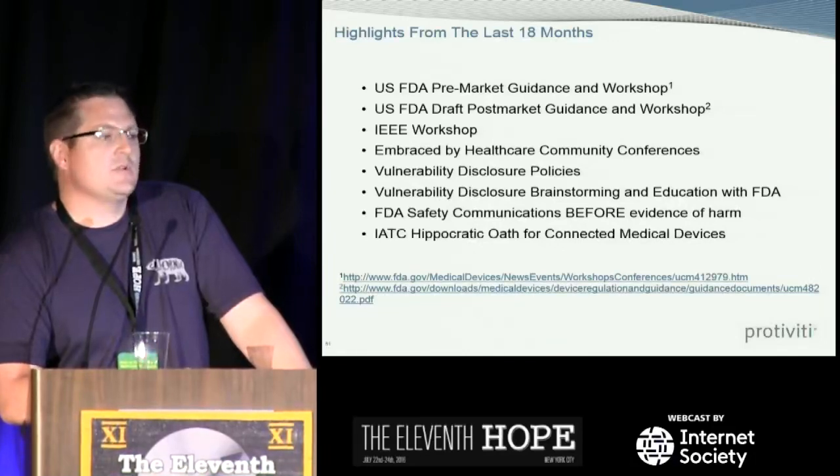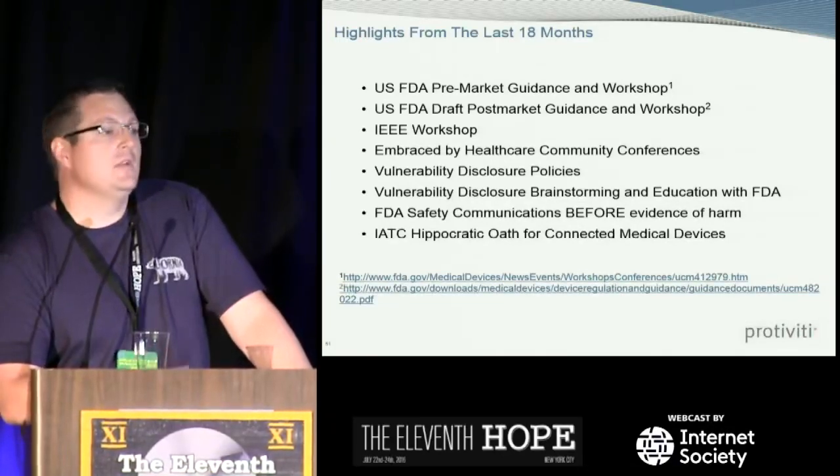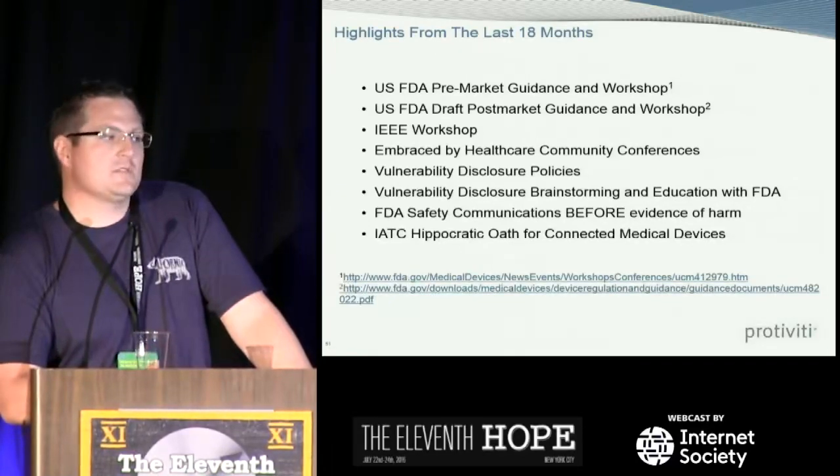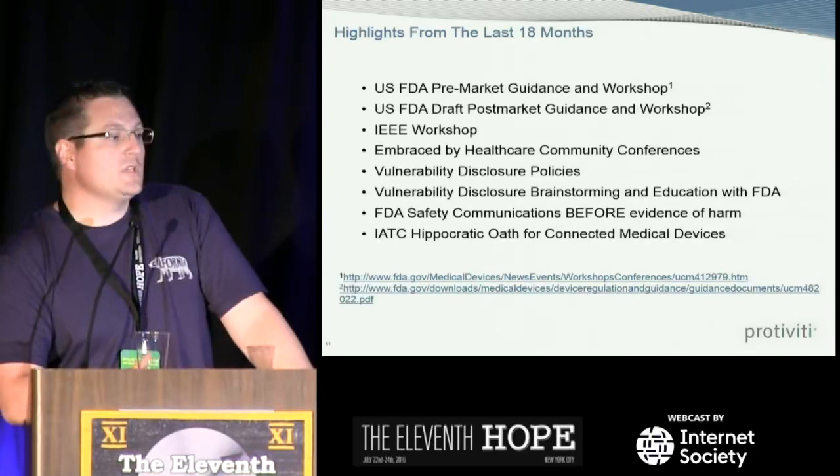So they released pre-market and post-market draft guidance. The draft guidance from a security researcher perspective is awesome. It's awesome for a healthcare provider too, that includes language that they have to have a coordinated vulnerability disclosure program and set some time limits around that. So that's a huge win, and that's a government agency working in collaboration even with security researchers.